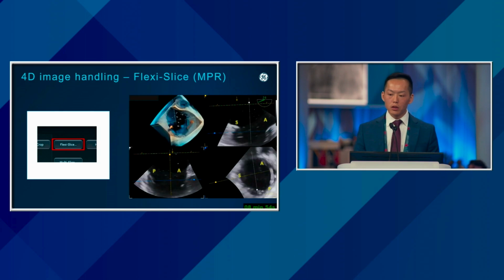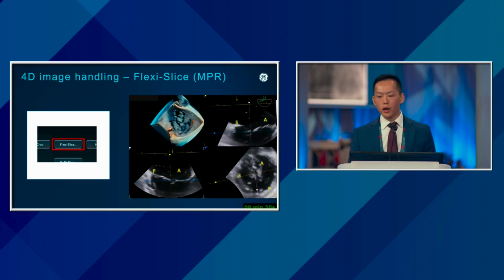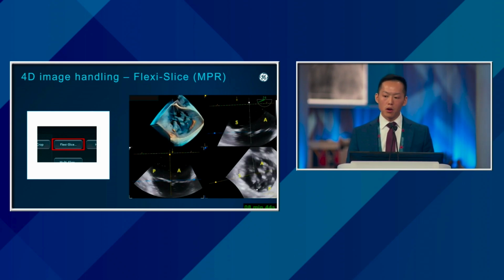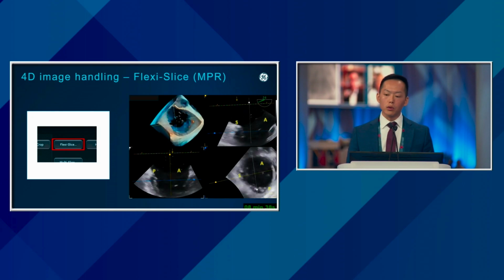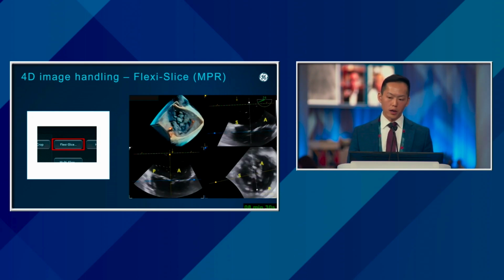So for example, here we see there's two short axis views, one in 3D, one in 2D, and we're able to generate off of that basically the plane that's parallel to the septal leaflet, and then also the orthogonal views which show our leaflet pairs, which in this case is anterior and septal. So, if we're thinking about devices that will actually interact with those leaflet pairs, it's really nice to be able to see them in those pairs exactly.